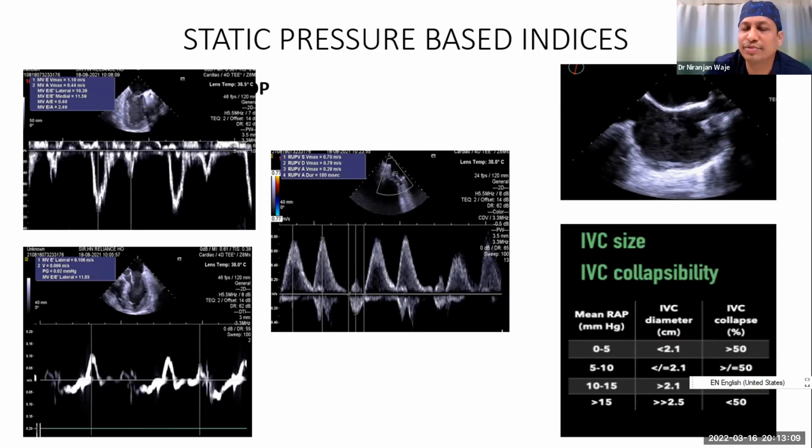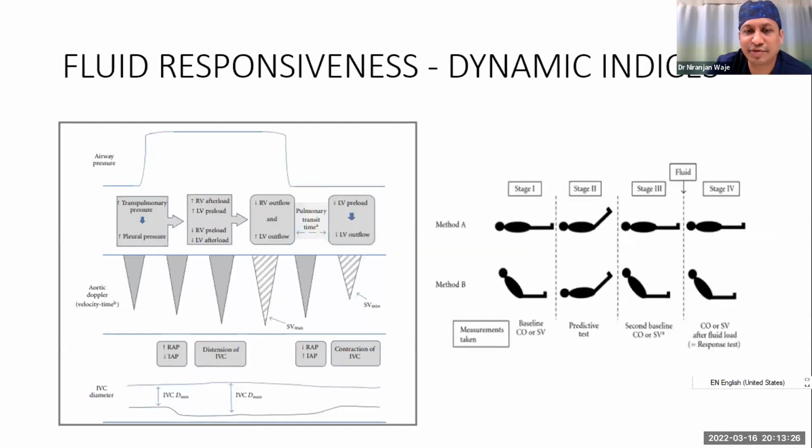Normally, in lung ultrasound, you do not see the vertical lines. Vertical lines are the B lines. Normally, you would see the horizontal lines, which they call A lines. If you see multiple B lines and confluent lines, it's a very good indicator that you probably need to diurese the patient. And these B lines would arise much earlier than your oxygenation will fall.